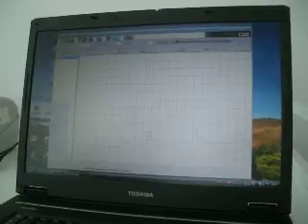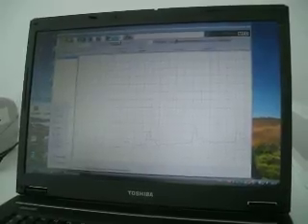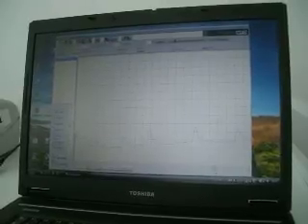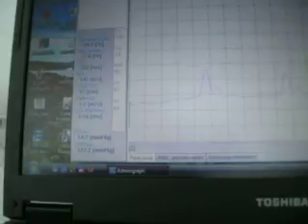This is the suprasystolic pressure step, from which the pulse velocity, augmentation index, and central systolic blood pressures are calculated. So you can see here the very characteristic waveforms of the suprasystolic pressure level. Now that's how long a simple measurement takes. These are the set of parameters that can be obtained with the arteriograph unit, and I don't think that it is much more uncomfortable than a simple blood pressure measurement.